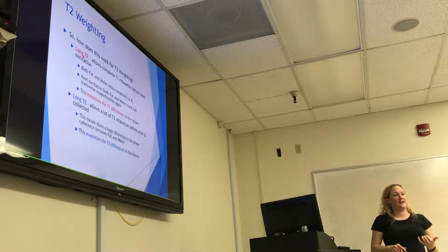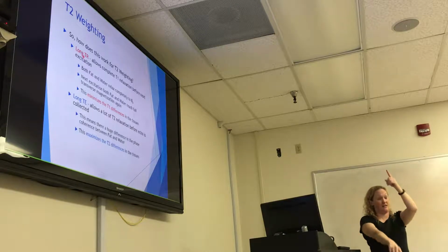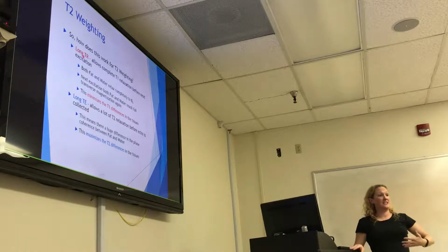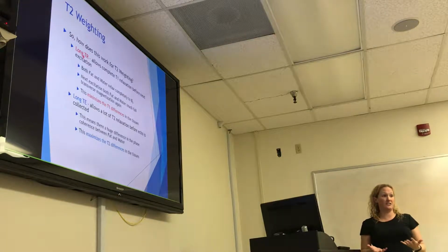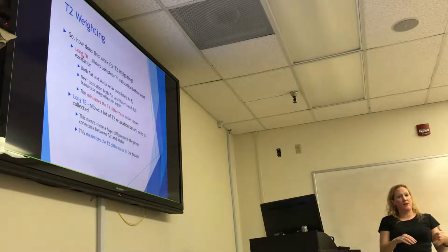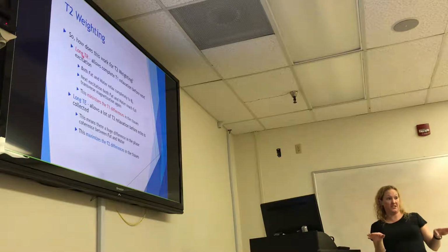What we want to look at is the dephasing differences between them in this transverse plane. All right, and remember, again, fat dephases very quickly relative to water. So if we wait a long enough time, the fat's going to be pretty much dephased, which means pretty much no signal.